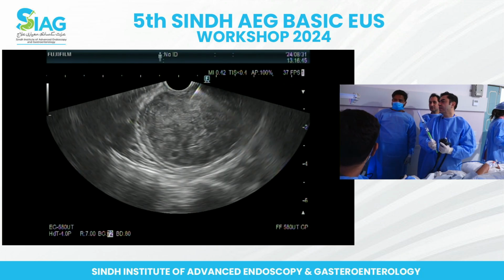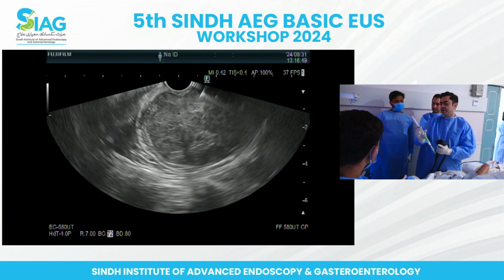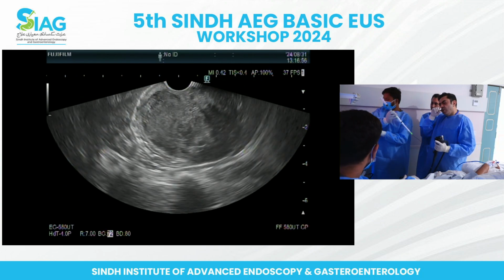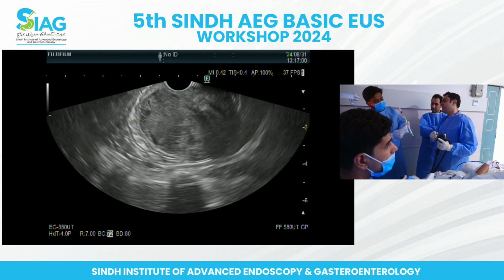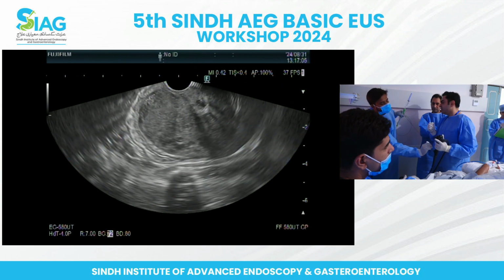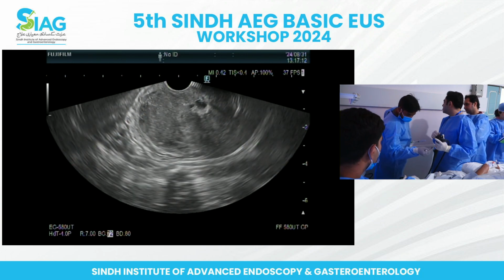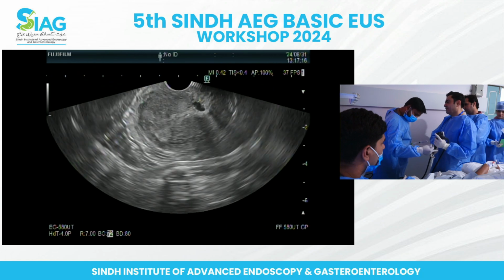Does it make a difference with a 10 cc or a 5 cc? No, it comes with one. It comes along with the needle, inside the packet. For the suction width, overall not really, but there are some people that say that if you are biopsying a lymph node, then if you have too much strong suction, it will produce more blood rather than cells. So in that you have got an argument of going halfway. But I don't think there are any studies to say you should use 5 on this one and 10 on that one. It's like a personal preference thing.